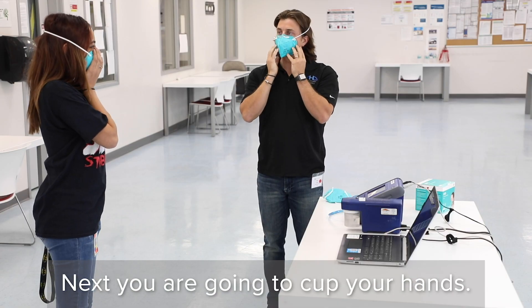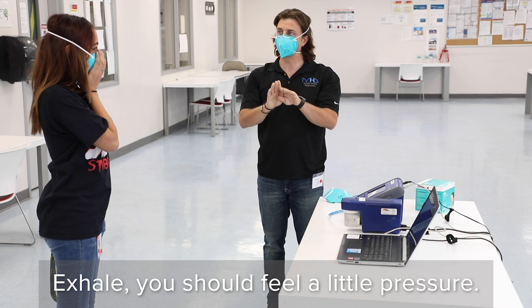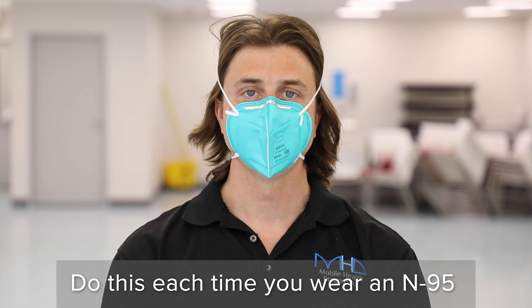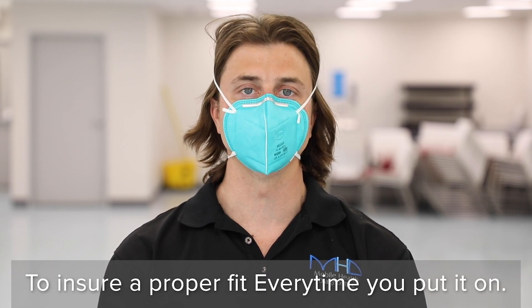Next, cup your hands, put them to the N95, and exhale. You should feel a little bit of pressure pushing against the N95. Do this seal check each time you put on the N95 to make sure it's fitting you properly.